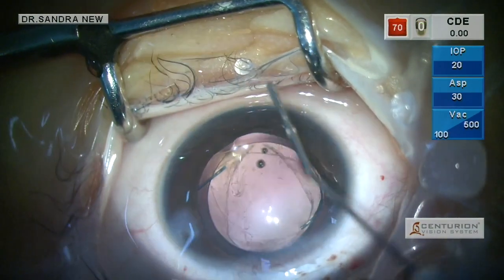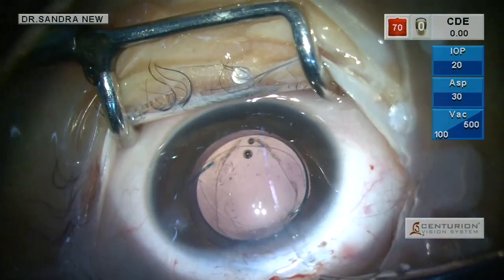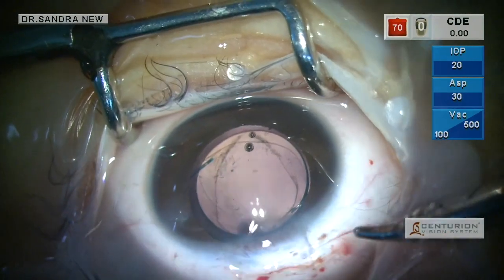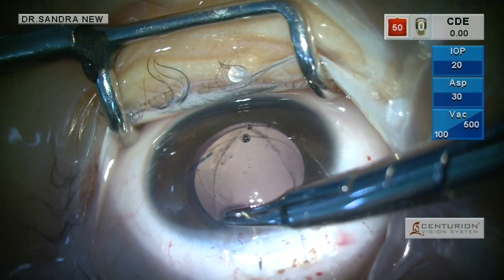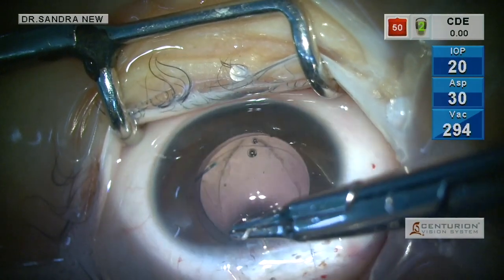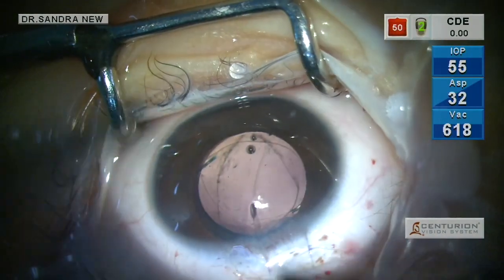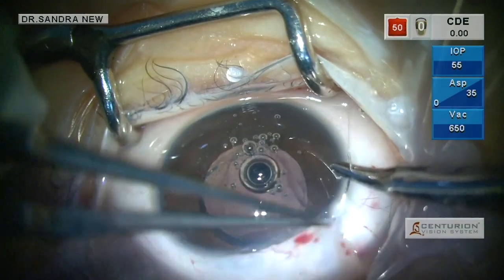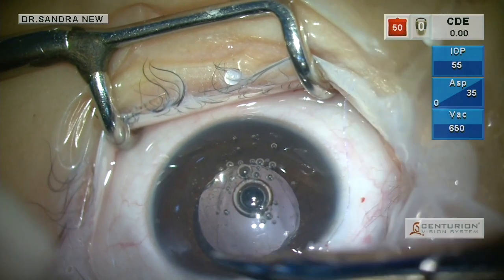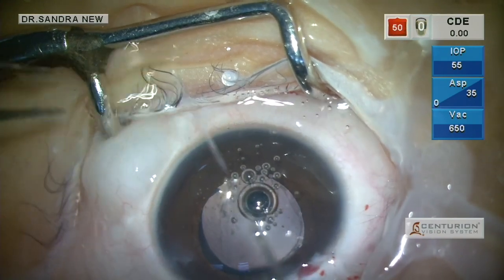After anterior vitrectomy and reforming the anterior chamber, the entry wound is being closed with two or three interrupted 10-0 sutures. I am using 10-0 Vicryl here, which is a delayed absorbable suture and need not be removed. These sutures will be buried under the conjunctiva and will be absorbed over a period of time. The conjunctival wound is also being sutured with the same Vicryl, and cautery is not used, making it very easy for the child to open the eye the next day.